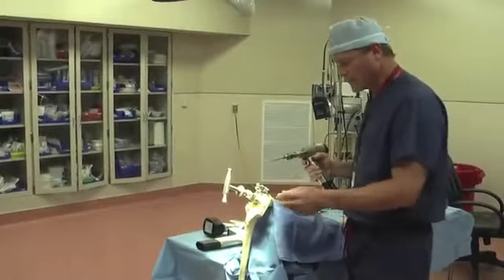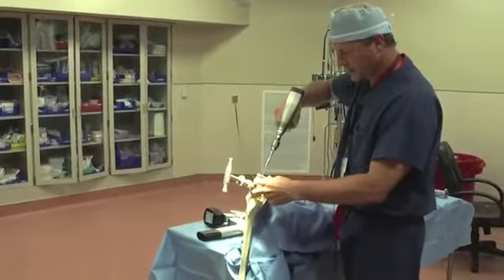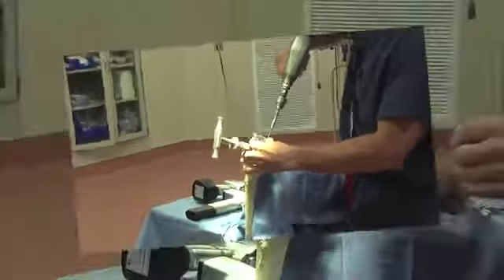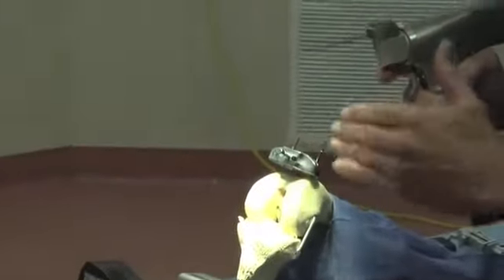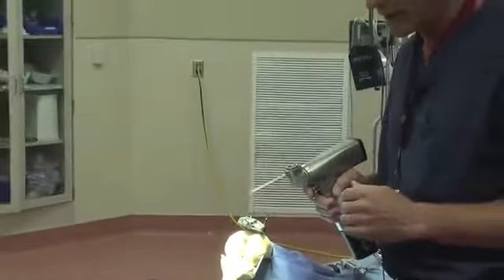Next we'll move over to this side of the table and pin this little block into place. We'll place that down and put the second pin in to give it good stability. Then we'll release this and pull the alignment rod off. If we like our distance we can actually adjust this — if we don't feel we're getting enough bone off, or we need more bone, or we want to correct the angle, we can do that at this point. Once that cut is made where we have it nice and flat and smooth, we'll go ahead and remove our pins.